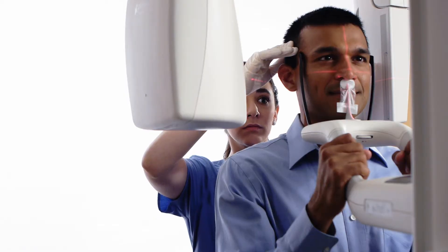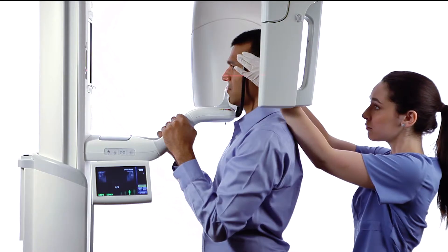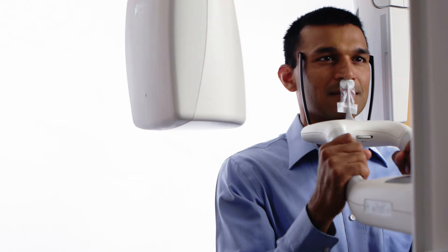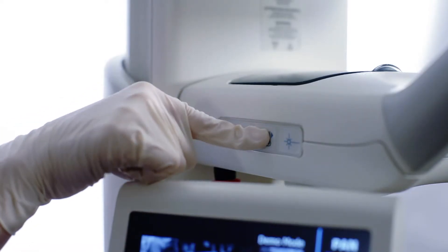Move directly behind the patient and gently rotate their head to align with the projected midsagittal laser. Be sure to observe alignment from front to back as well as from top to bottom. Close the head support wands.